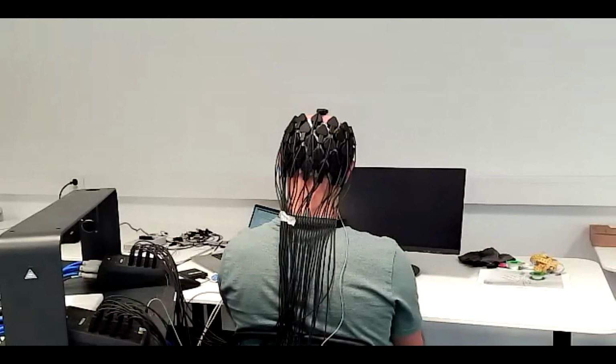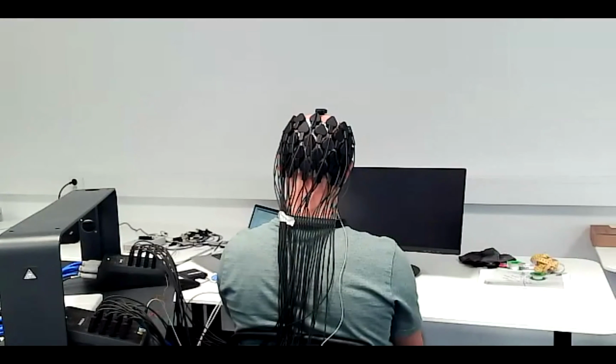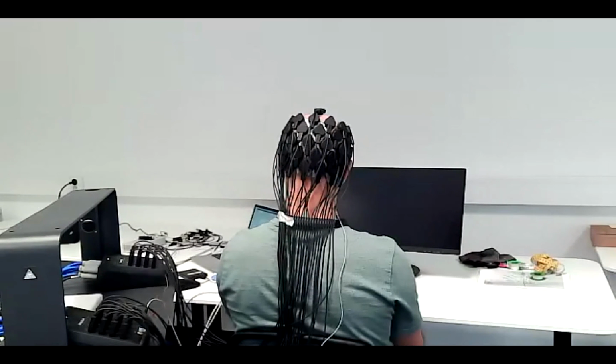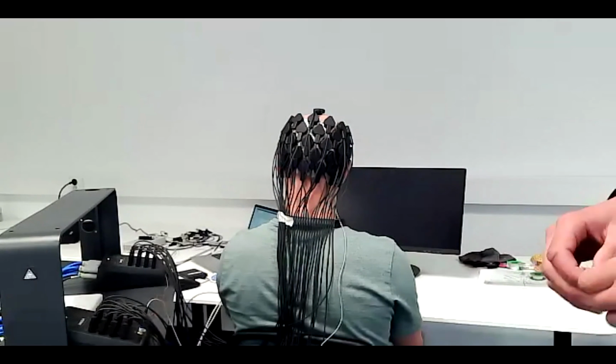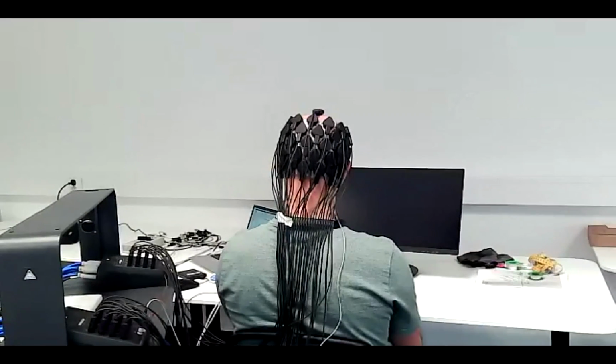So what we are doing are visual experiments. So we have run with different paradigms today. I will show you a bit around how we do the system setup with the Pangolin, and then we'll run an experiment and show you some visual EPs and topographies that we plot online.